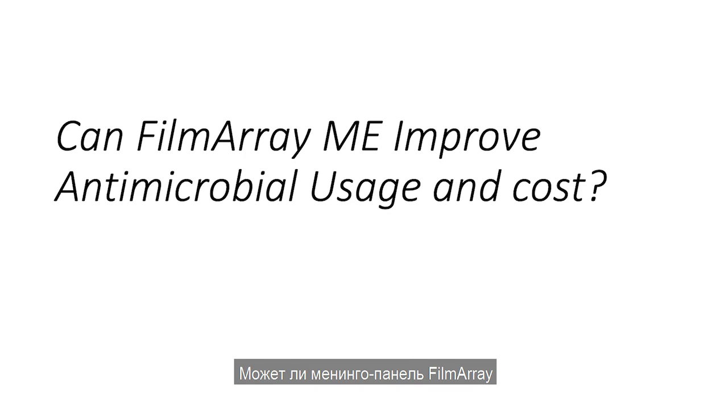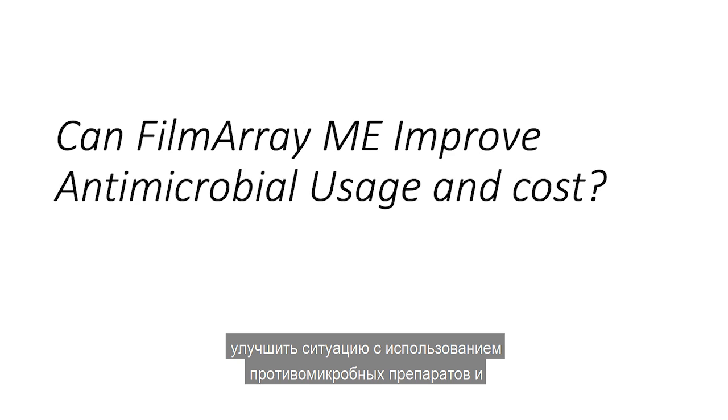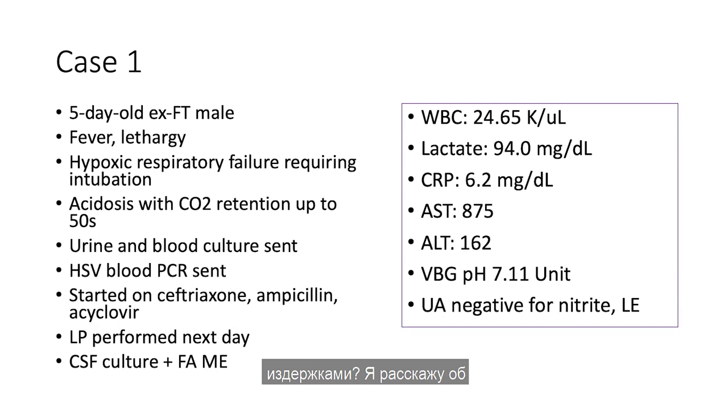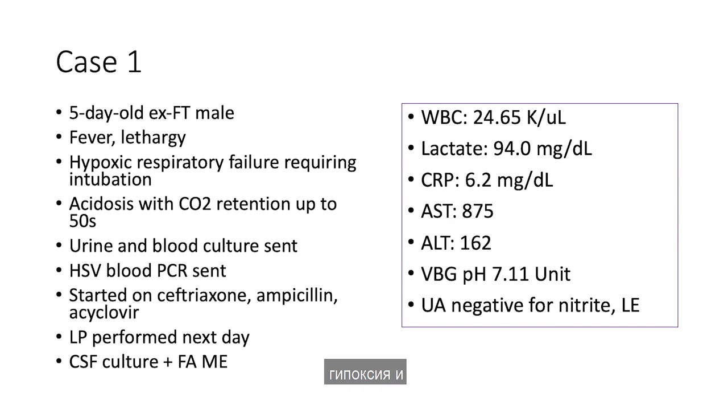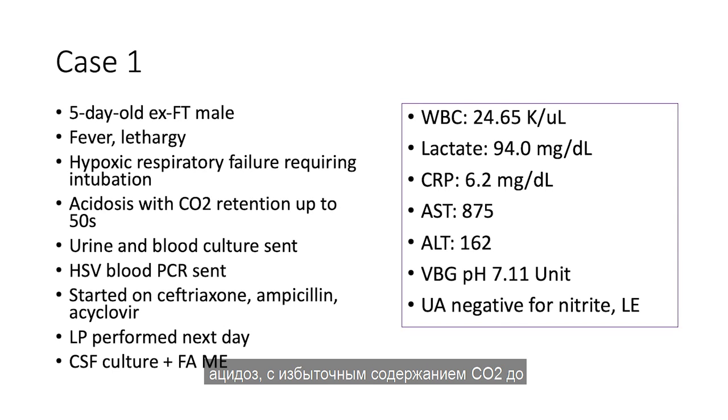So can the FilmArray ME panel improve antimicrobial usage and cost? I'm just going to present one quick case, a recent case that we identified in our institution. This was a 5-day-old ex-full-term male that presented with fever and lethargy. He was hypoxic with respiratory failure that required intubation. He was acidotic, had CO2 retention up to the 50s.